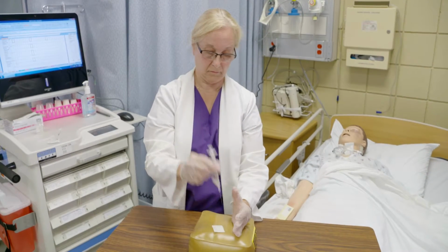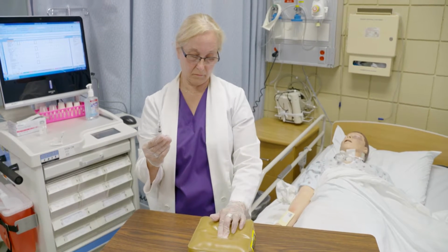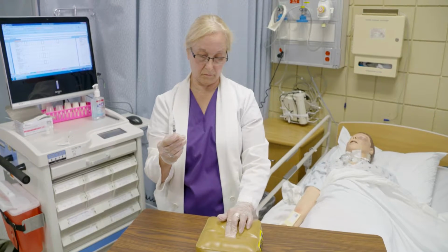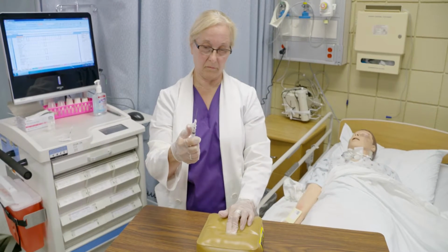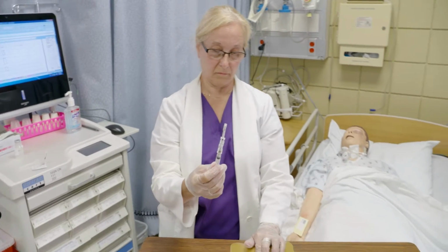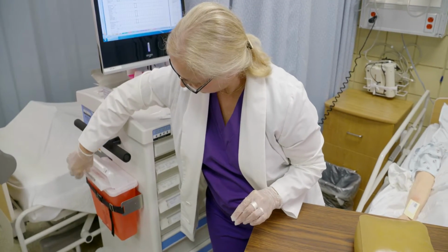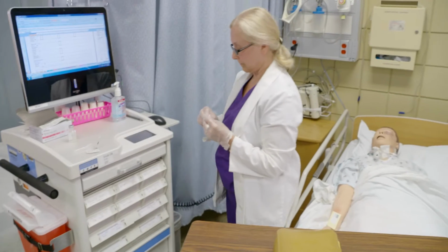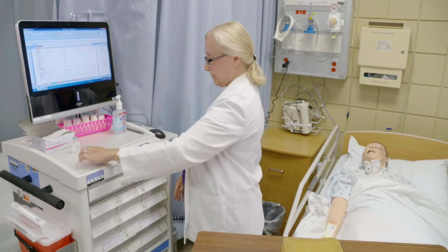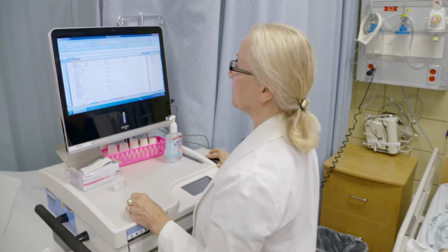Withdraw the needle and let go of the muscle and press the alcohol pad over the injection site. Do not massage the area. It could cause the medication to leak out from the muscle. Activate the safety guard using your thumb to cover the needle. This prevents you from being stuck by the needle. Discard needle into needle sharps container, putting the needle end first into the opening. Remove gloves, perform hand hygiene, and document both of the medications given.